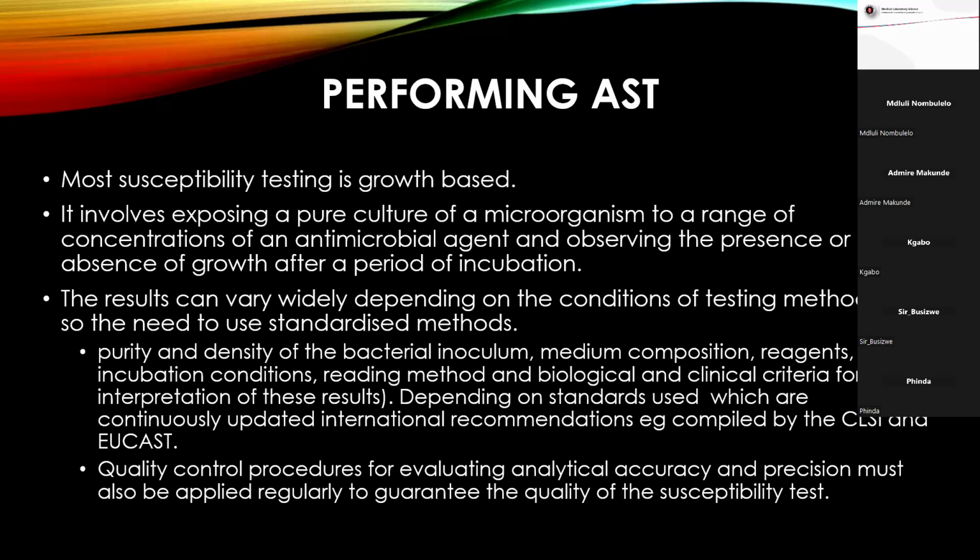I've said there are several AST methods which are used. Of note, these AST steps are guided by certain standards. I'll go more into the standards as we go, and now more into the specifics.